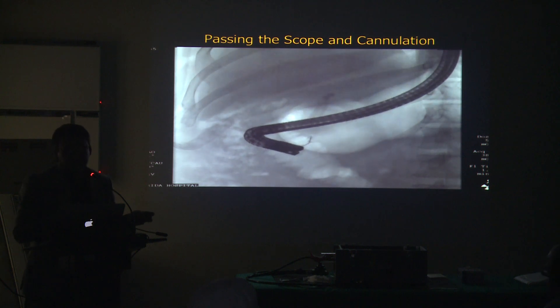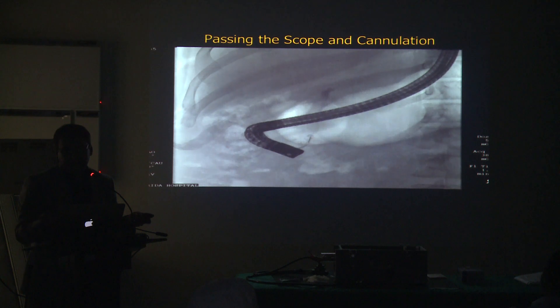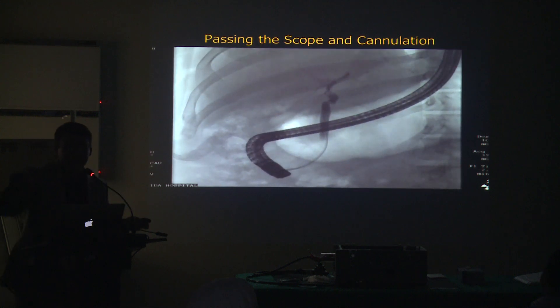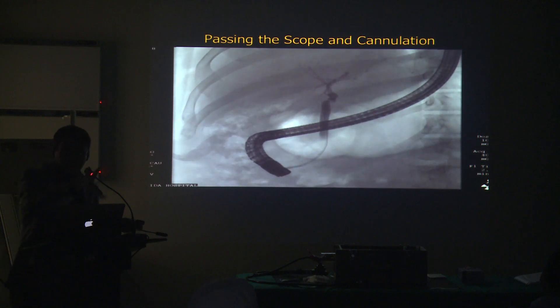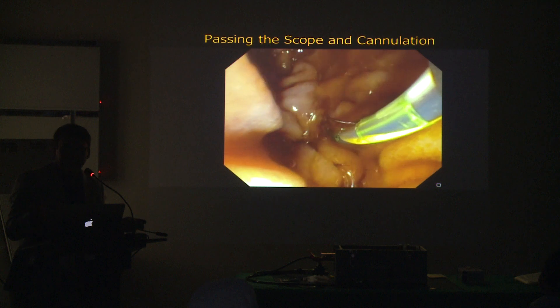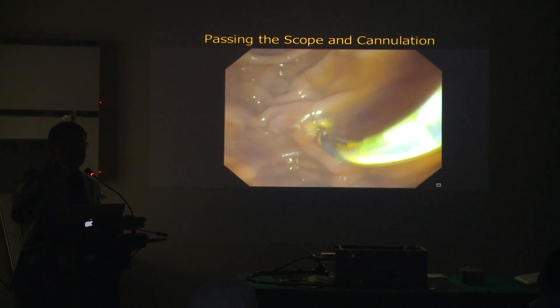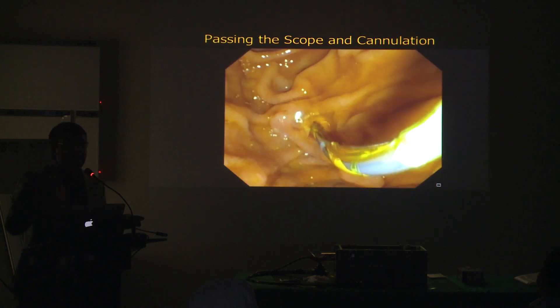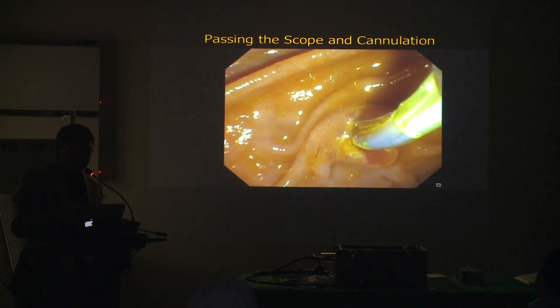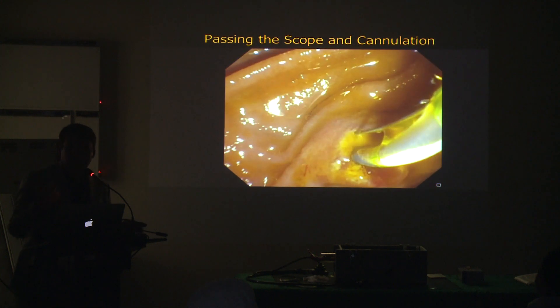If it's not going in, I inject a little bit just to get an idea of where it is. It's a little bit of an up-and-over papilla, and there was a little diverticulum there too that might have distorted it. So I tried the wire gently — it didn't go through. I decided to inject because I was nicely engaged into the orifice. Do not inject unless you are nicely engaged into the orifice, because otherwise the injection is all going to come out. After you are engaged, again gentle injection, very slowly. Do not push hard — if it's not going, there's a problem. Just leave it and re-engage.